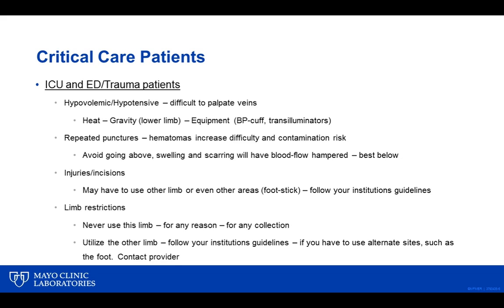Yeah, just to reiterate what Danny was talking about there in regards to limb restrictions, recognize that the most important thing here as we move through this presentation is please, follow your institution's policies and guidelines. What we share in this is not the end all to everything, but recognize that a limb restriction is just that. It's not a limb restriction for like IVs or line placement. It's a limb restriction for venipunctures. It's a limb restriction for even a capillary collection.